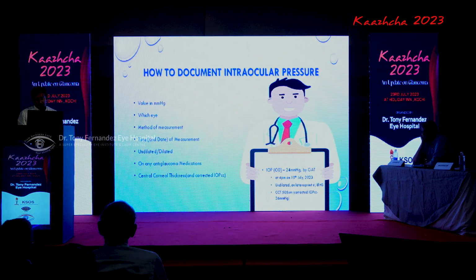Whether the eye is dilated or undilated, whether the patient is on any anti-glaucoma medications, what they are, the last medication used, what time it was used, etc. The central corneal thickness and also the corrected IOP will be useful. So this is an example of how a complete documentation of an intraocular pressure should be. So the PGs note that these things are all important.